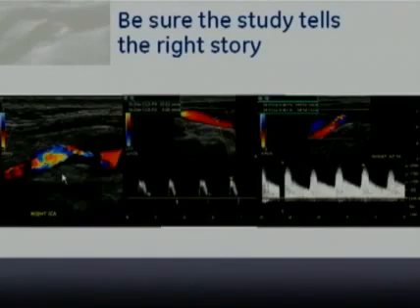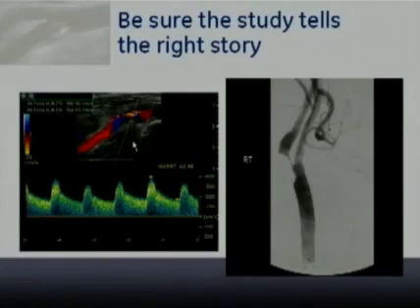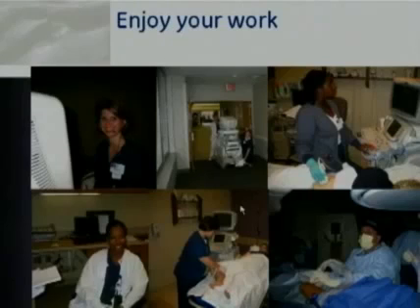So we brought the patient back down to look again, and as suspected, the highest velocity in the internal carotid artery is actually closer to 400 centimeters per second rather than 200, so nearly doubled. Part of that had to do with the sampling location. She had not walked the Doppler through the entire area. She was sampling just distal to the area of maximum stenosis. By going back and forth and walking through there, I was able to pick out the highest velocity more accurately. And you can see here an angiogram that shows this very high-grade stenosis, consistent with the findings.